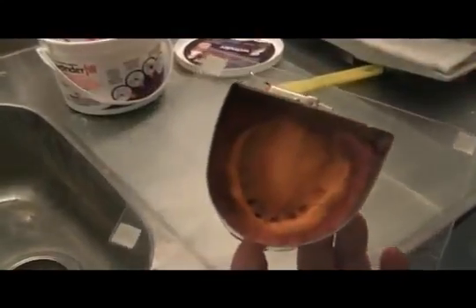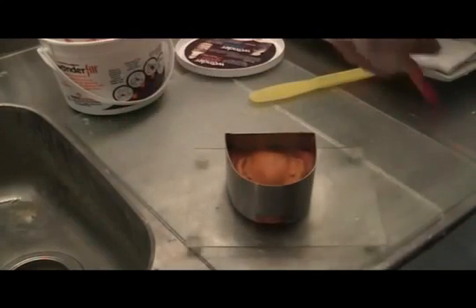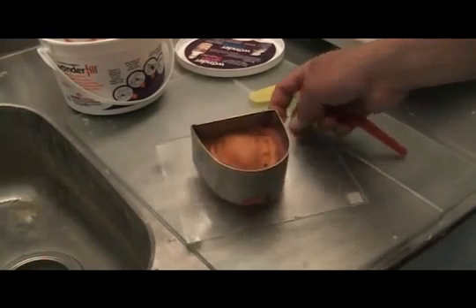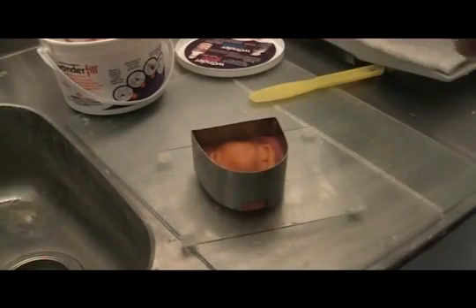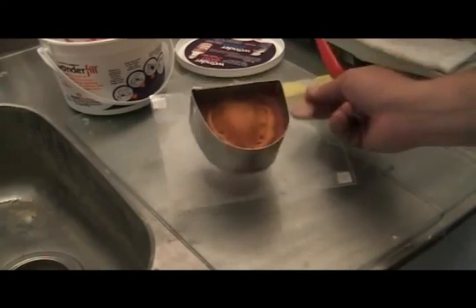And as I show in my lectures, the math on this really works well for the labs, because this technique for boxing would take generally about 20 minutes if you were to wax in land areas and wax in a tongue, and then take your boxing wax and box the entire thing with a form. And this is just really quick and painless, and very cost effective. As I mentioned to people, I'm actually boxing non-border molded impressions just because of the ease and because of how nice it all looks when it's all boxed, poured, and trimmed. It just looks really phenomenal.